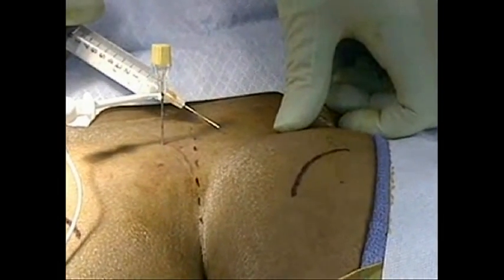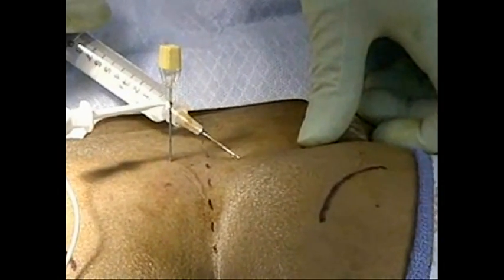I'm going to let the patient know there's going to be another poke for the anesthetic.